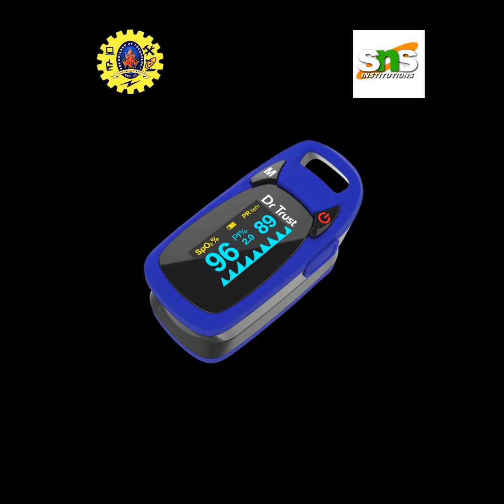The pulse oximeter uses light to work out the oxygen saturation. Light emitted from the light source across the pulse oximeter probe reaches the light detector. If a finger is placed between the light source and light detector, the light will pass through the finger to reach the detector.